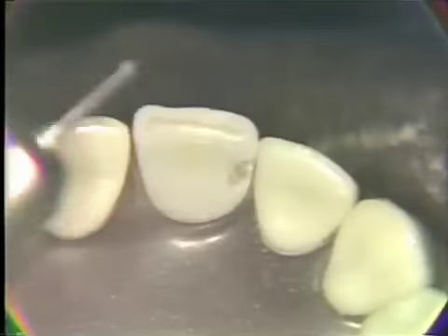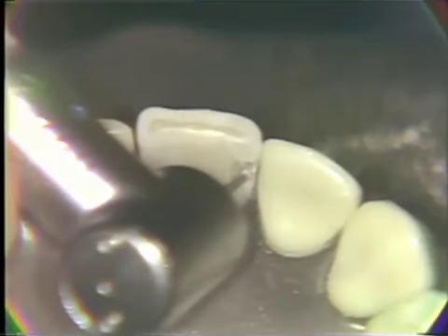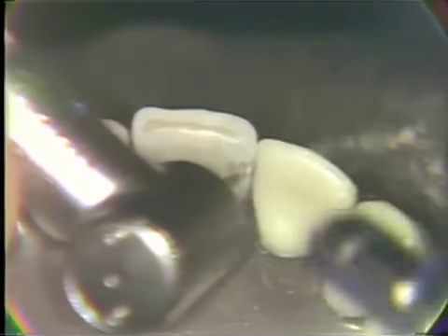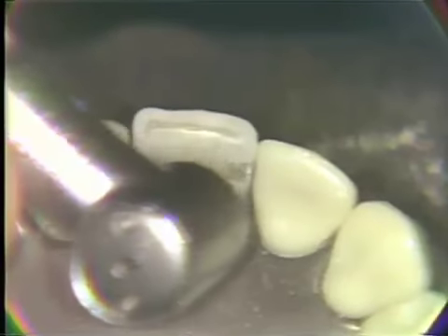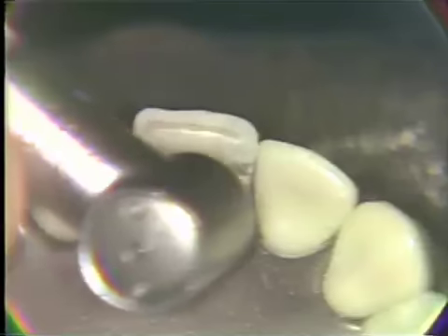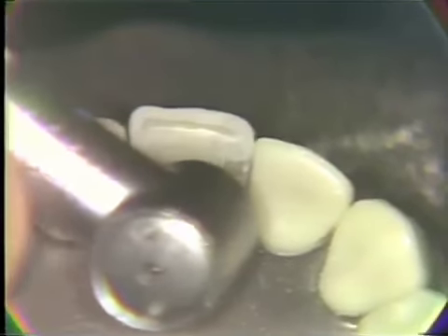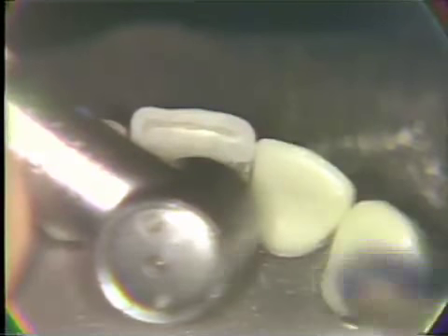With the half-round burr, we'll be placing the minor retention in the labial axial cervical area into the dentin, and then moving back to the lingual axial cervical position with a greater amount of retention. This is more significant.